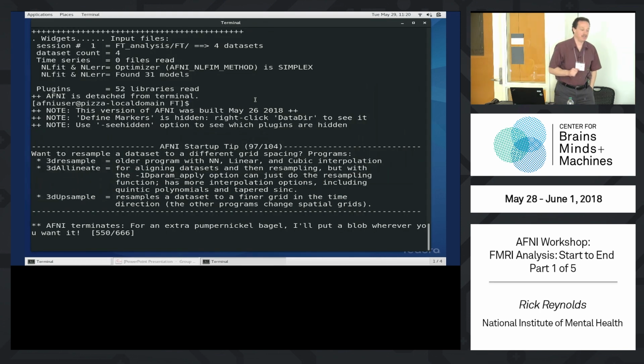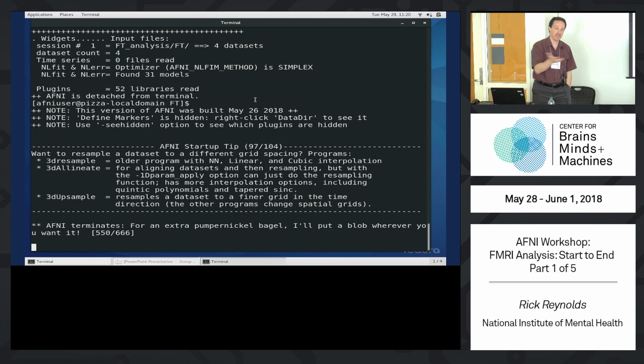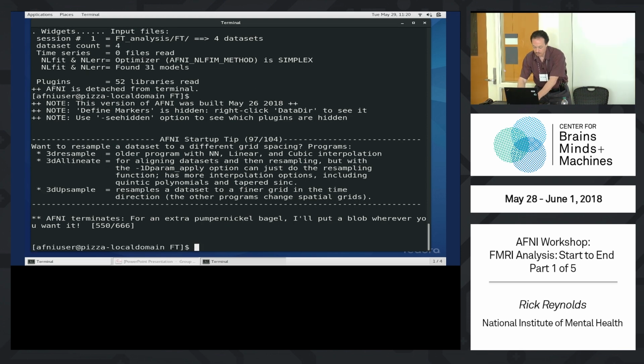You spend a lot of time on analyses; the full study can take years, right? Even to collect one subject's data, it takes time to contact them, set up the scheduling, get them down to the scanner. Multiple people have to worry about the scanner. It's very expensive. You collect the data, spend a few minutes looking at it. The few minutes you spend verifying that you've got good data is well worth the investment in getting all this and writing a paper that you're going to put your name on. So, you know, look at the data.